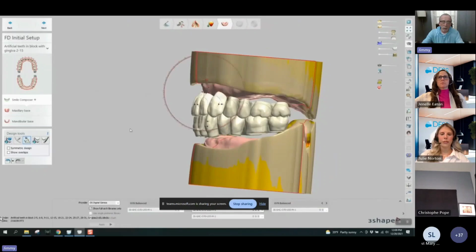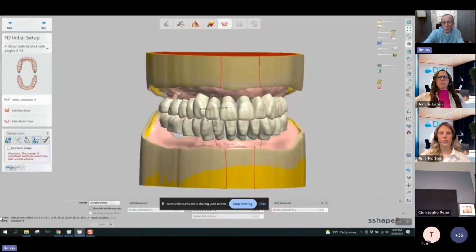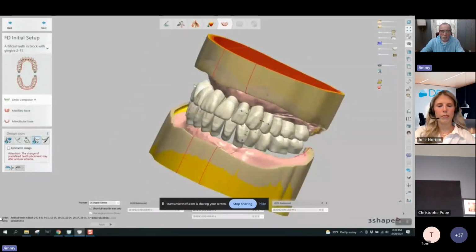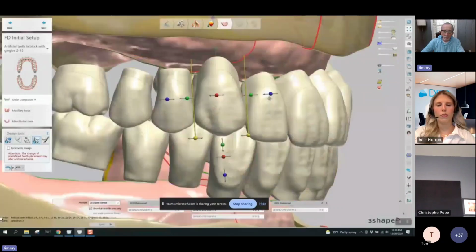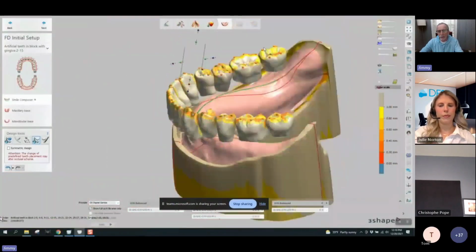If you notice, I scale that case down just a little bit. Like this mold might be perfect, but if it was just a little bit smaller, it'd be even more perfect. And we just don't have that kind of freedom when we're using carded teeth. But being able to do this in half the time, that's really changed our game as far as the denture workflows. And this just translates over to the implant.